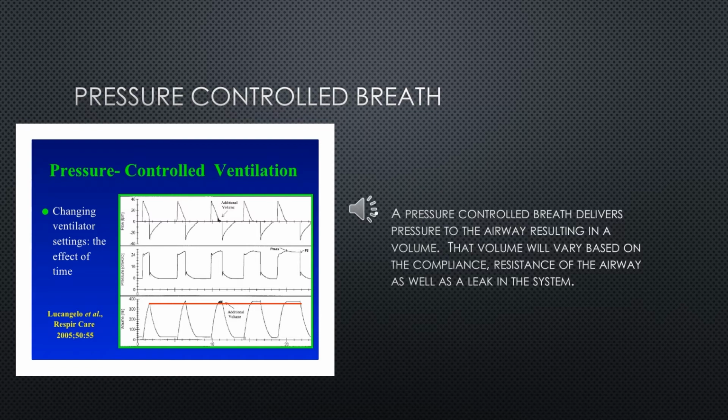Once we put that pressure in there, based on the compliance and the resistance, we'll generate a volume, and that specific volume will come up on the screen for us as an exhaled volume, and that will give us an idea. And then we can look at their compliance and resistance on there.